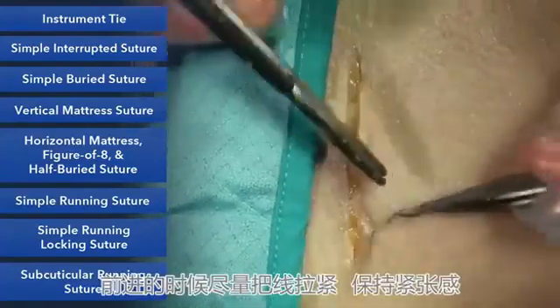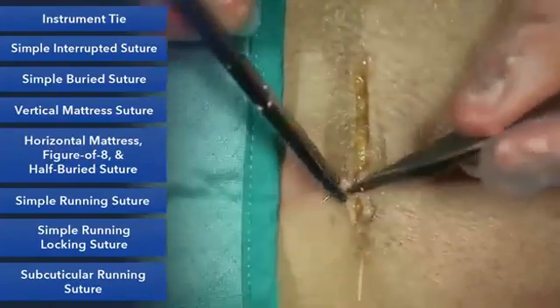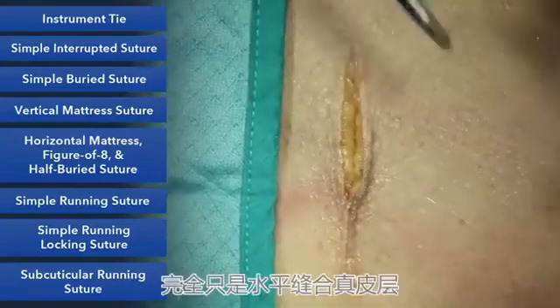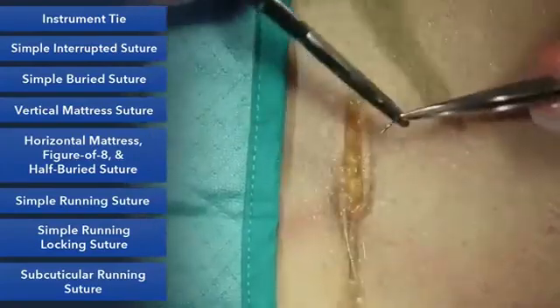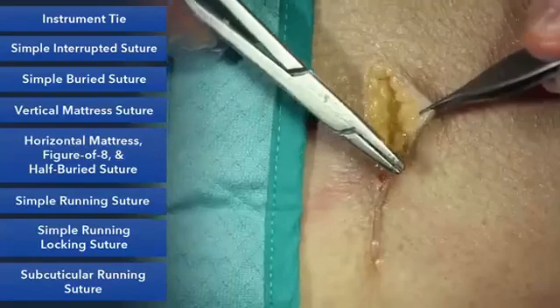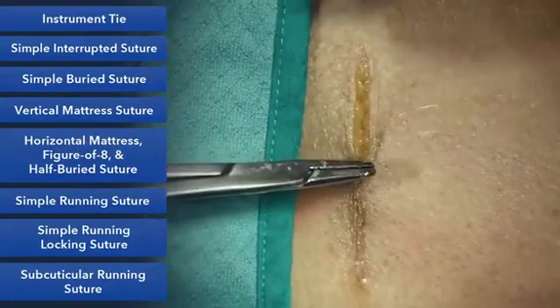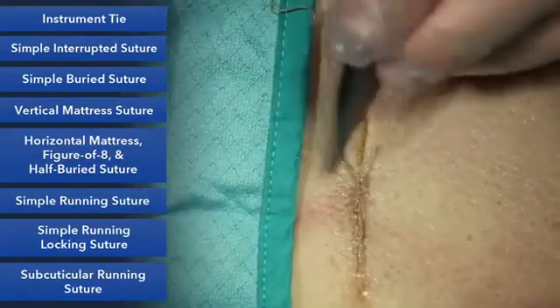As we begin to advance, keep pulling everything up and keeping tension. Notice I'm not pulling up very tight either. We're just getting the skin to approximate. No buttonholing of the skin. This is just pure horizontal dermis. Wants to come right there. Again, get a good bite of the dermis. Wants to come right there.